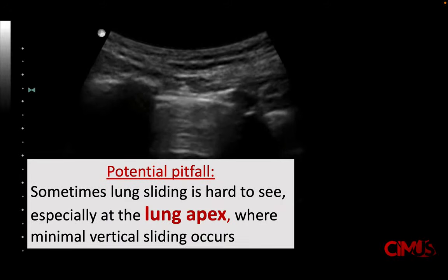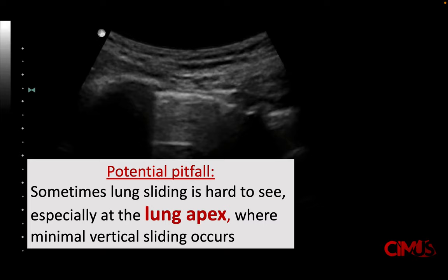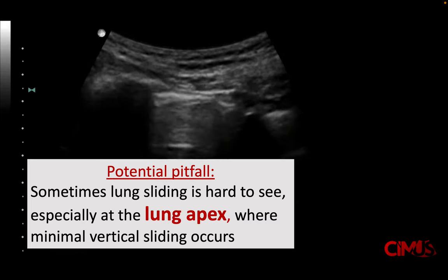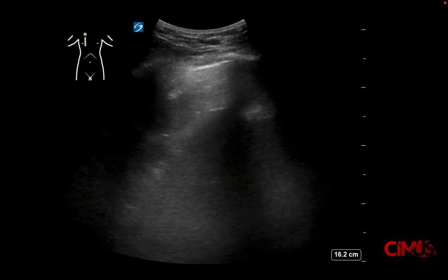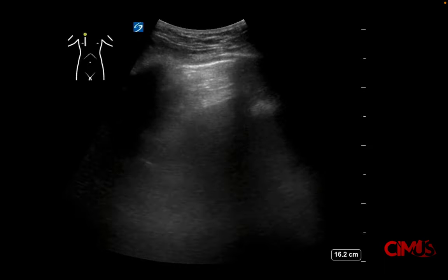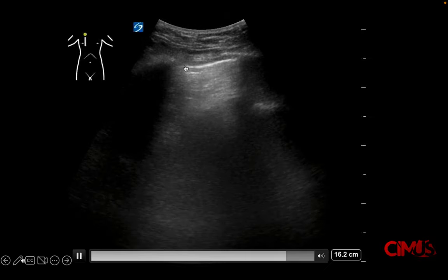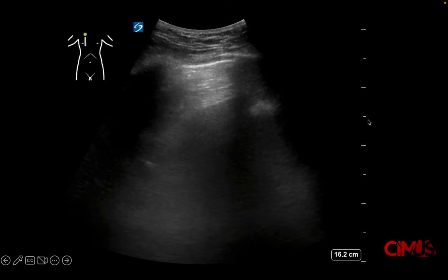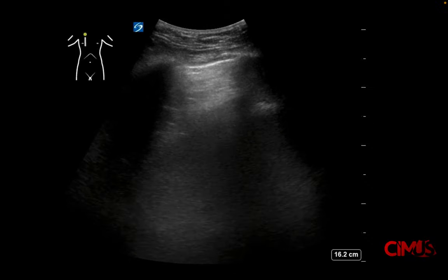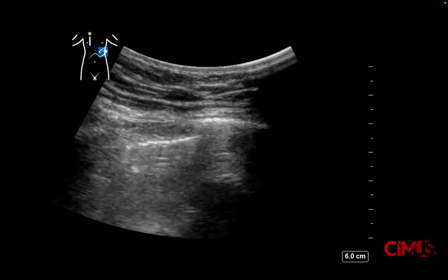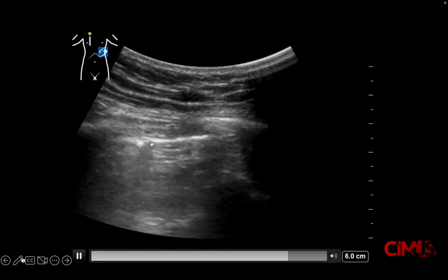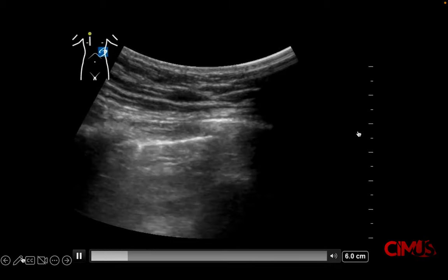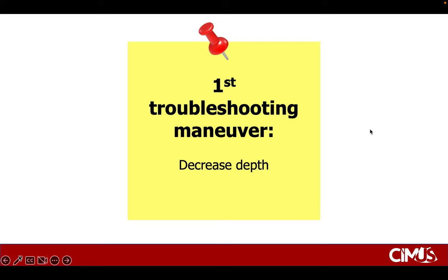However, lung sliding is sometimes really challenging to see, especially at the lung apices, where there's very little vertical sliding. Here's another example where the pleural line is seen but it's a little hard to tell whether there is any lung sliding. Decreasing the depth can allow you to visualize that lung sliding movement a little better — that's the first troubleshooting maneuver.